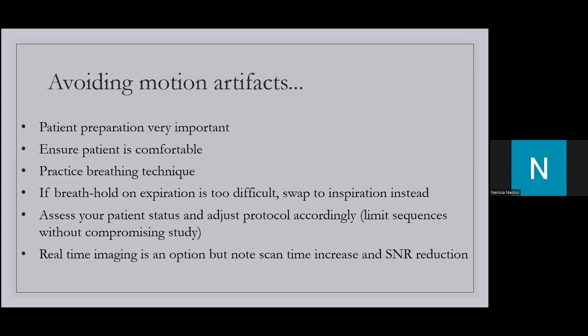Sometimes we may be quick to say to the patient, please breathe in, breathe out, and hold your breath, but we actually need to practice it with them. So stand right next to your patient. It does take a long time, and you physically show them what you are expecting of them.